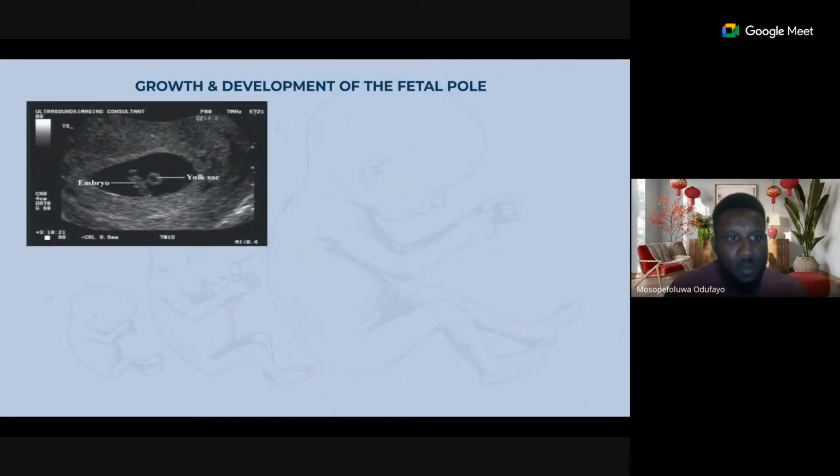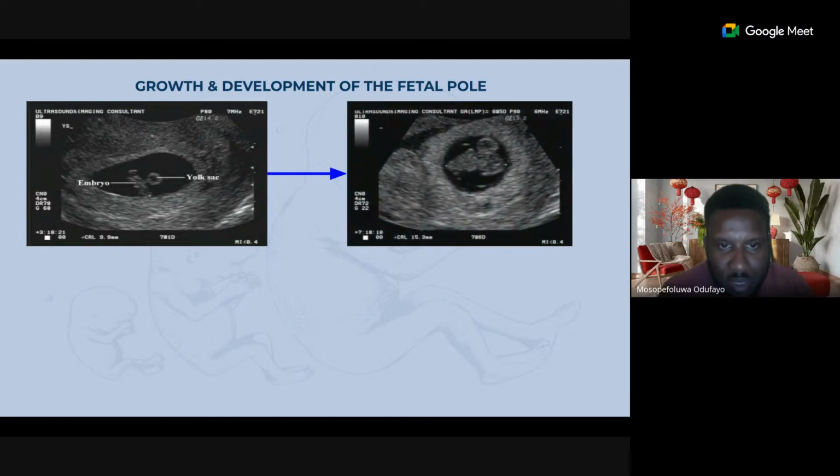And so then what now begins to happen to the diamond in the ring? As you can see, first of all, the diamond has gotten a little bit bigger. It gets bigger than the ring. So that's the embryo beginning to develop. Is that okay? And then it becomes a lot bigger. Is that okay? As you can see here, and the yolk sac is still over here.